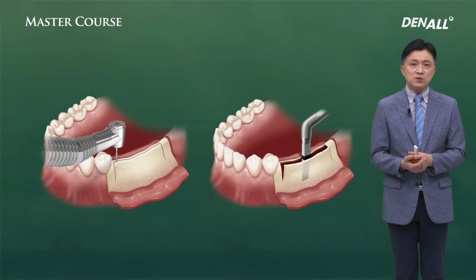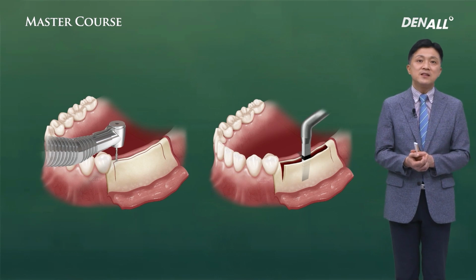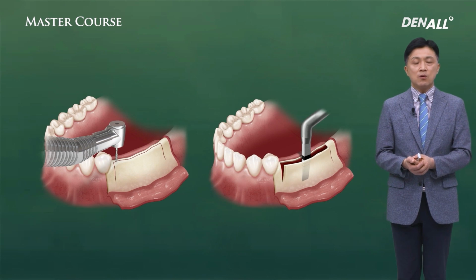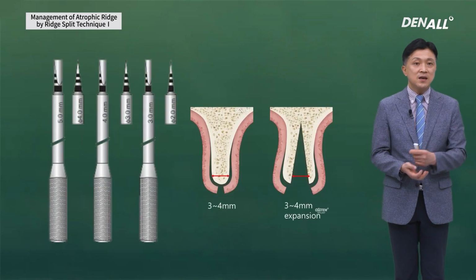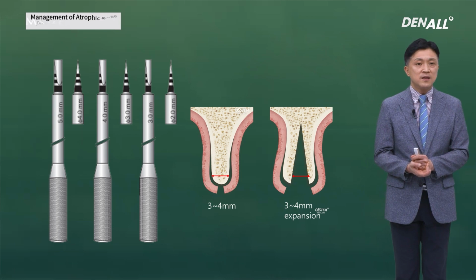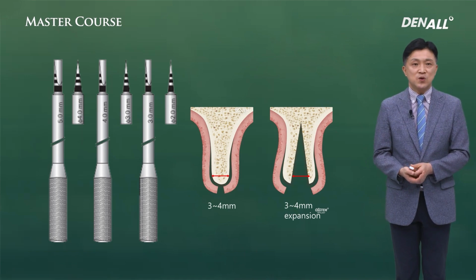The problem is that vertical osteotomy was imperative. You need to do a vertical releasing incision to be able to do vertical osteotomy. The downside is that the surgical field expands, and with this, the patient discomfort increases. A ridge splitting osteotome is used to widen it. This was used frequently, but it is associated with many problems.